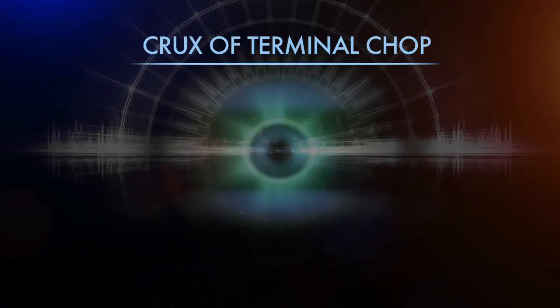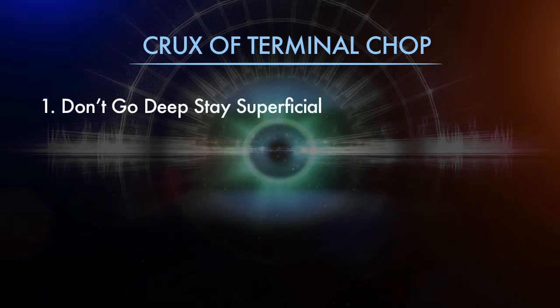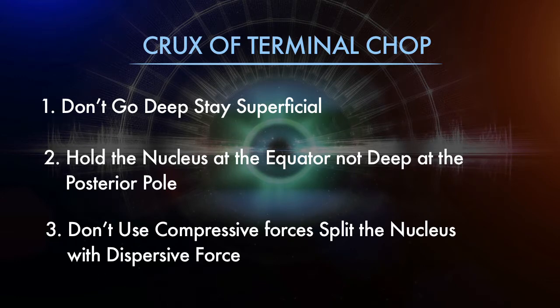The crux of the terminal chop is, don't go deep, stay superficial. Hold the nucleus at the equator, not deep at the posterior pole. Don't use compressive forces, split the nucleus with dispersive force.